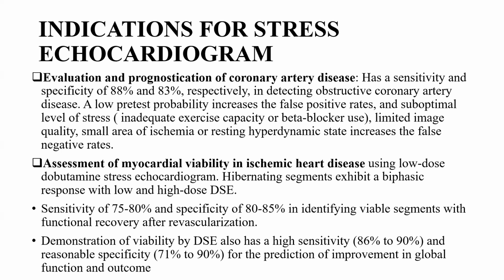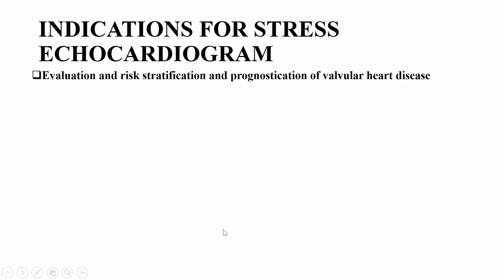Now, if you're able to demonstrate viability by the dobutamine stress echo, it has a sensitivity of 86 to 90% and specificity of 71 to 90% for predicting improvements of the patient's global heart function and outcome. So it's a very good tool to use.